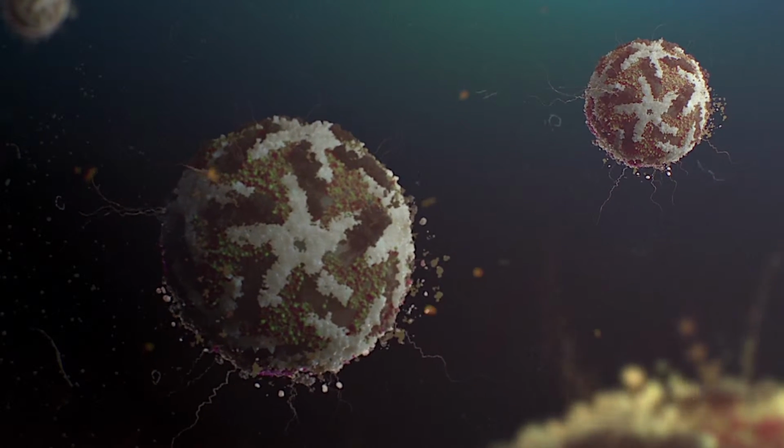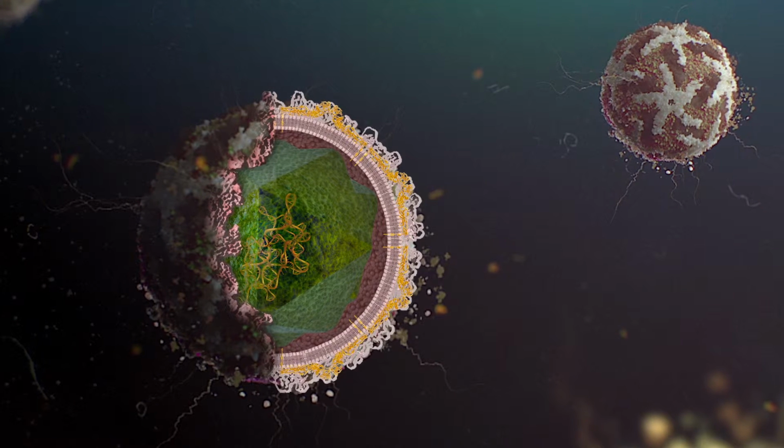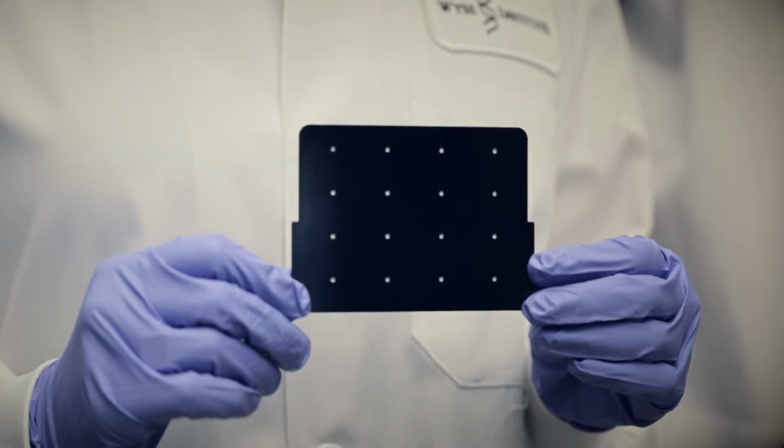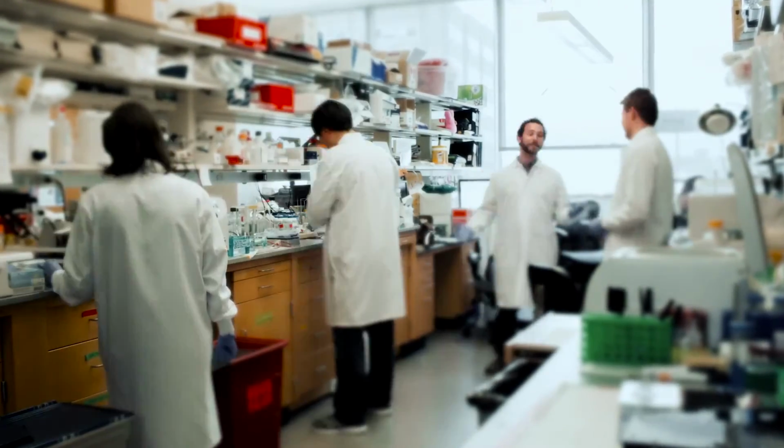We initially looked at sequences of the Zika virus from the field. We could actually identify regions of the RNA genome that lent themselves to the RNA-based sensors that we developed in the context of our synthetic biology platform. We then went the next step and developed a whole workflow, figuring out how you could process patient samples.